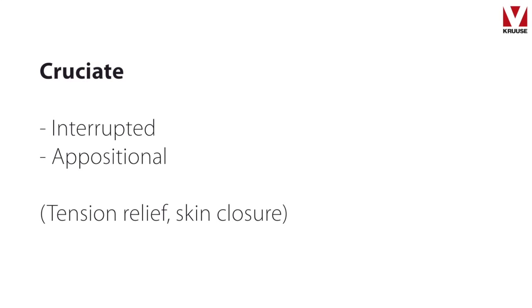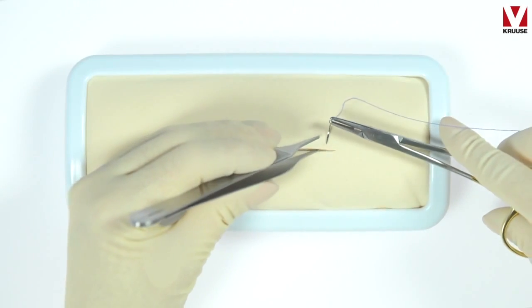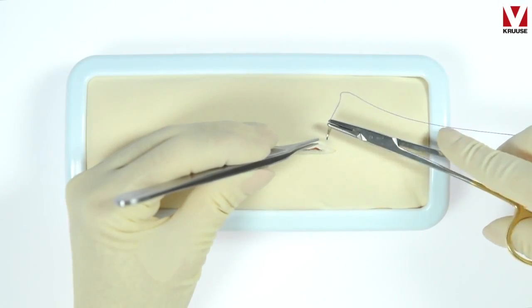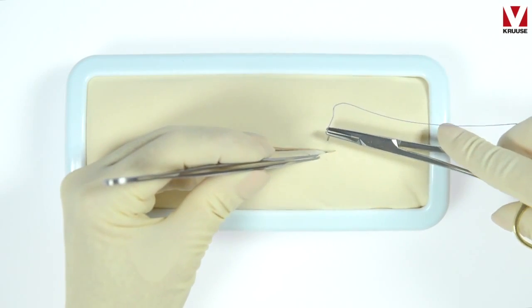Cruciate Suture Pattern. This is an appositional and interrupted suture pattern which will give tension relief and is especially good to use in skin closure.